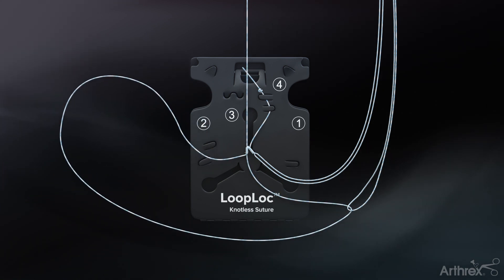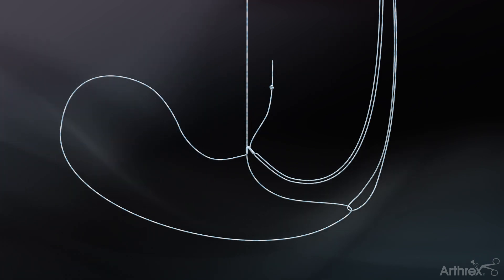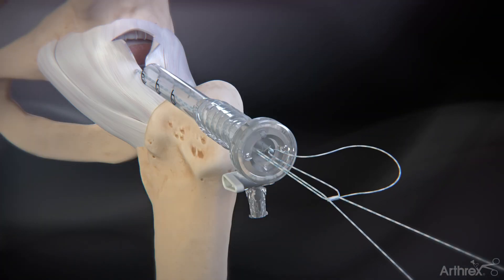Once the splice has been completed, remove the short suture tail labeled number four and remove the remaining suture from the tabs and dispose of the packaging card. Even out the two strands of suture.